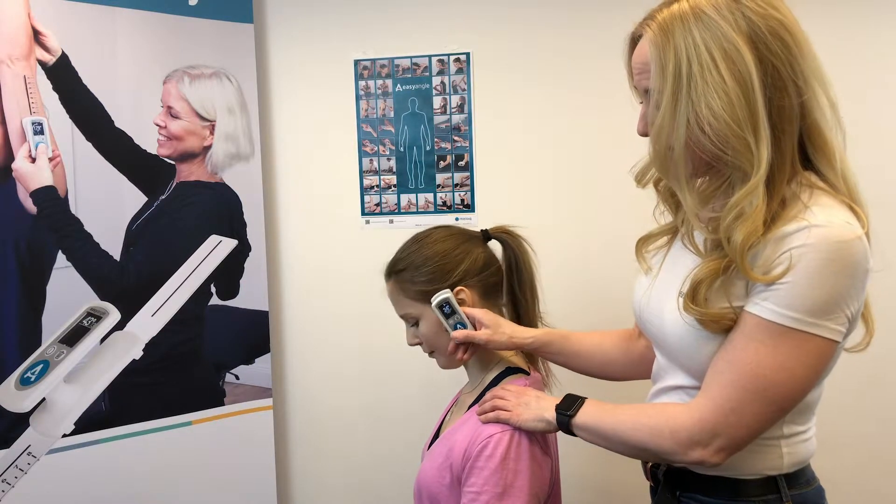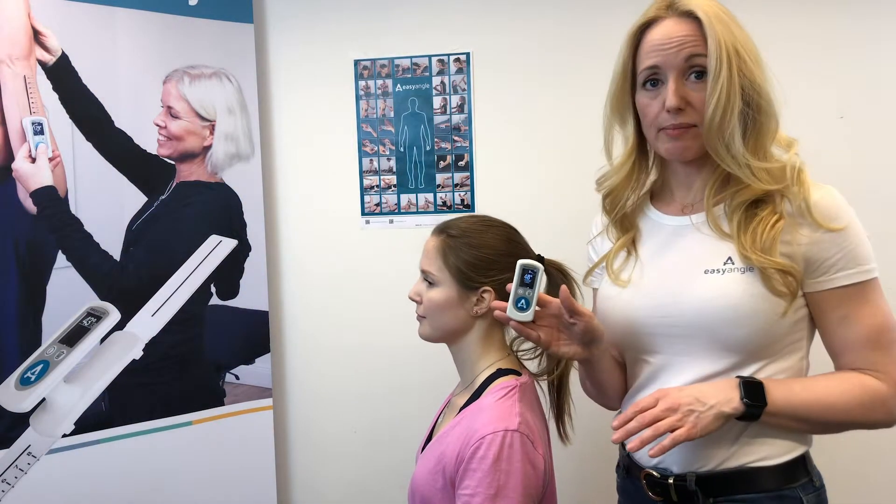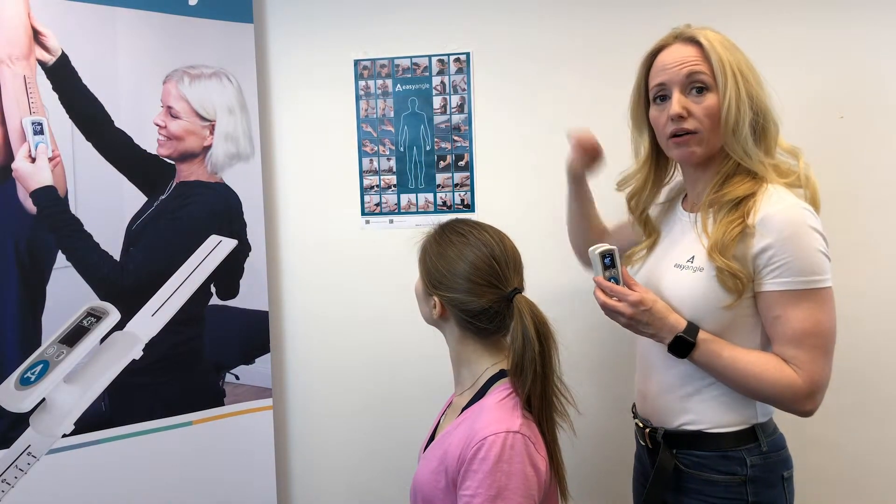We press the button to start the measurement and then have the patient move to their full range of motion, and then we get the measurement on the device. That's demonstrated in the top right-hand side of our poster.